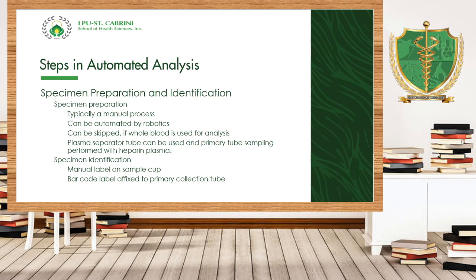specimen preparation can be skipped if whole blood is used for analysis. Hindi na kailangang i-centrifuge kasi whole blood ang kailangan mo. Usually, whole blood ang ginagamit, I want to make it clear, usually, no? Depending pa rin kasi yon sa sample or sa machine na gagamitin mo.